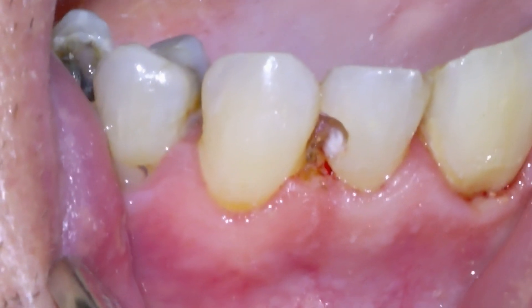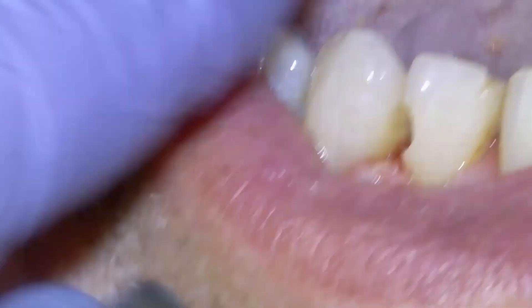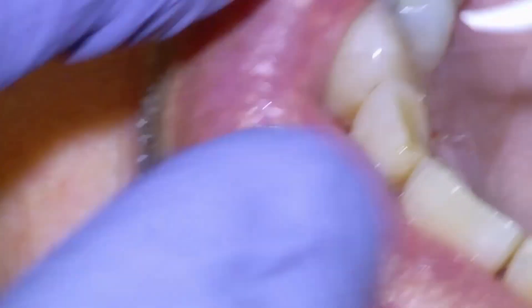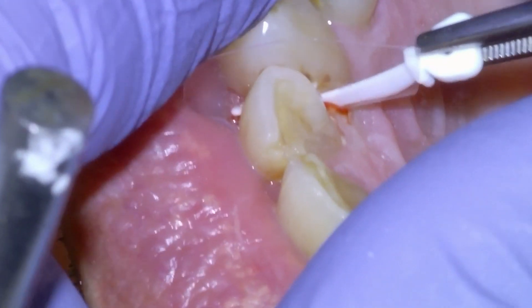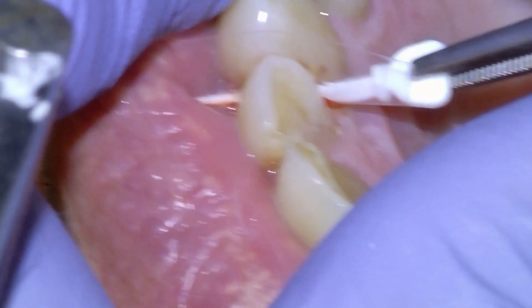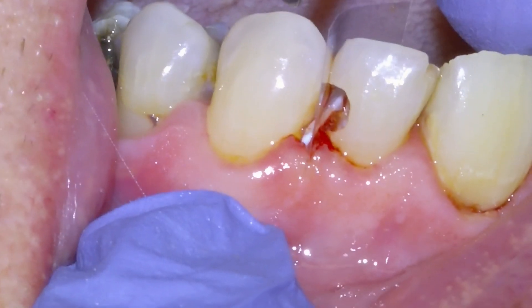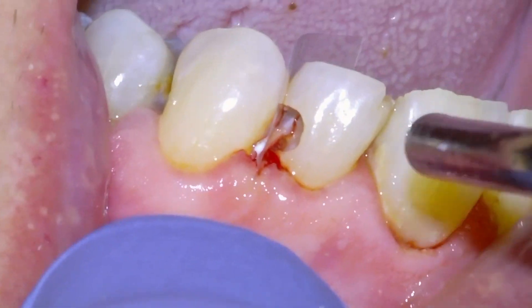This is a tooth that's now ready to be filled in. Before we can place our filling we need to place this little plastic band to hold in place, so we're going to put the band in between the teeth and then stabilize it using this plastic wedge. The wedge gets placed to stabilize the plastic band, and now this tooth is ready to be filled in.